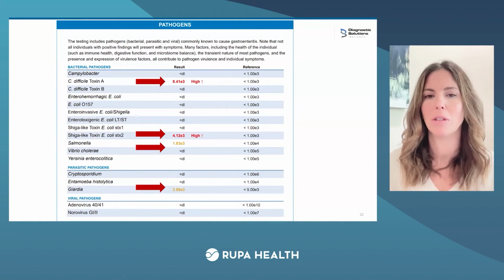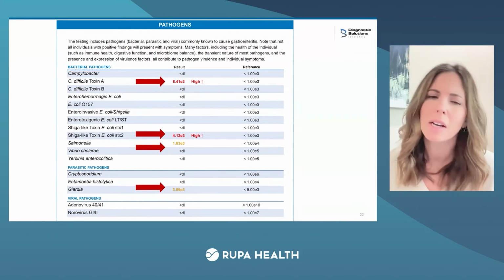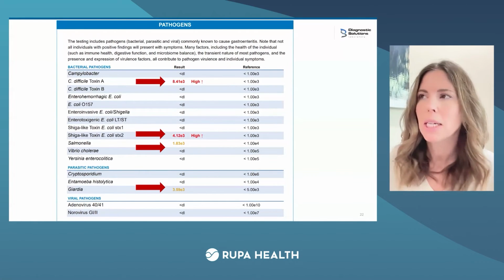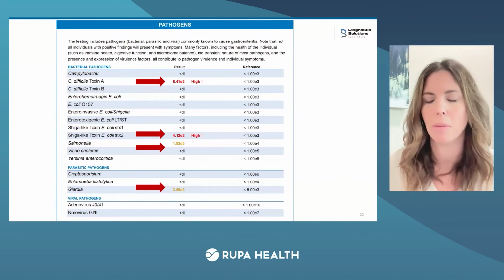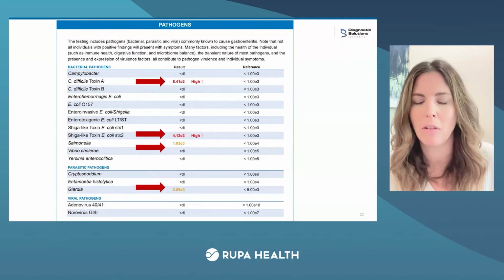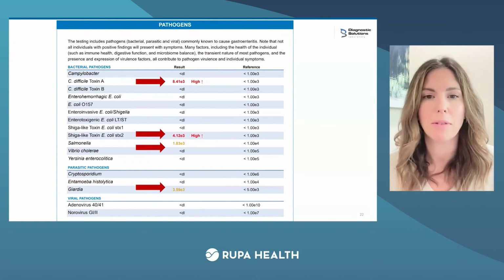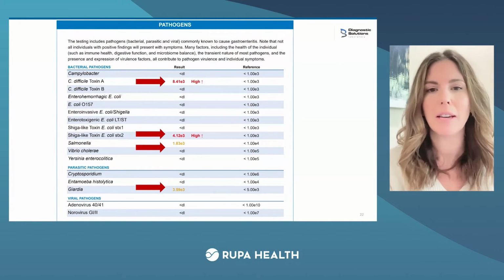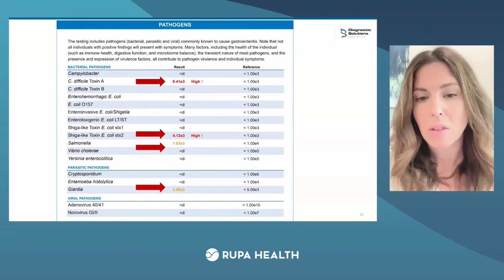So I have a higher threshold at which I will tolerate a bit of inflammatory dysbiosis, not always in a 3-year-old, but around 18 months to 2 years of age, it is really normal and natural to have exposure to some gram-negative organisms, to things that are non-self, non-normal, and that is important for the immune system to interface with, to develop that self versus non-self. But now, for a child that has 4 pathogens present, this is not normal. And it's also not common.